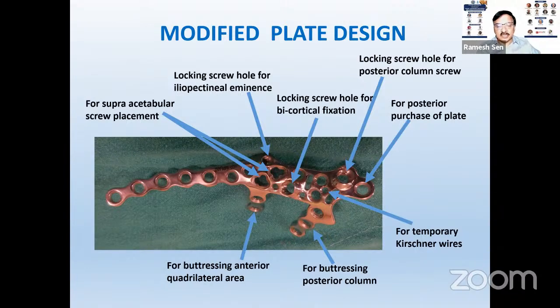This is the newer design. There were many issues at that stage. Now, here we have got the same, as I told you, the posterior most screw. This is the locking element. This is the medial inside out element.